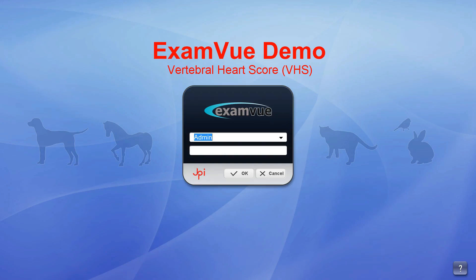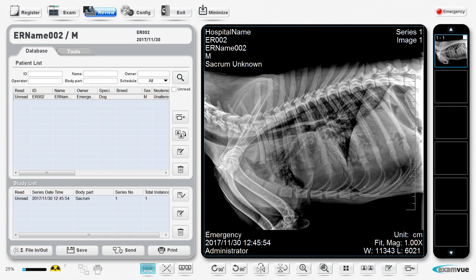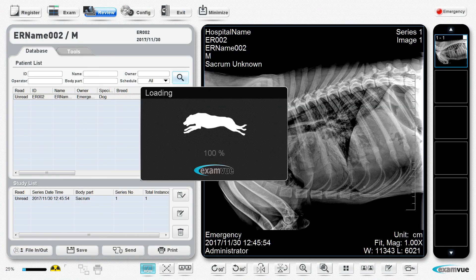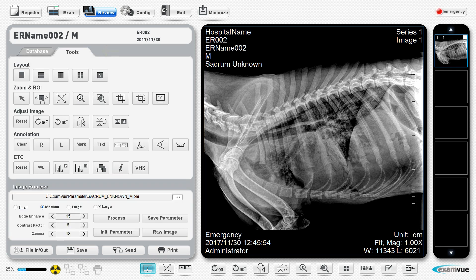In this tutorial, I will demonstrate the vertebral heart score tool using ExamView DRVET. The first step is to select the image from the review window. Click on the VHS button.